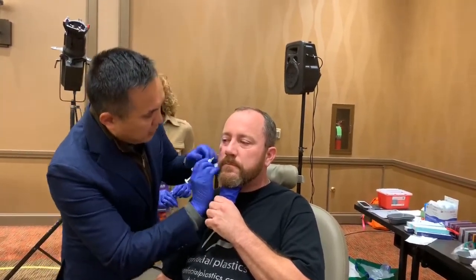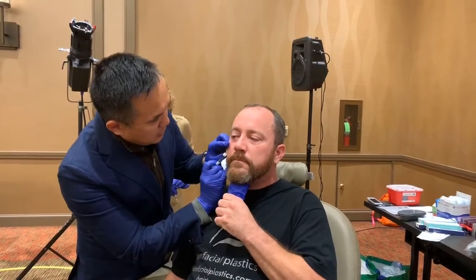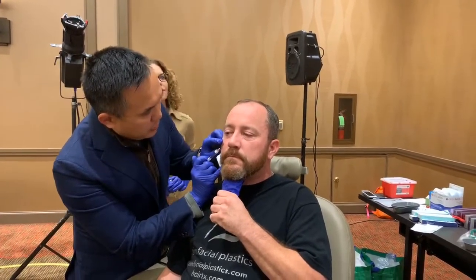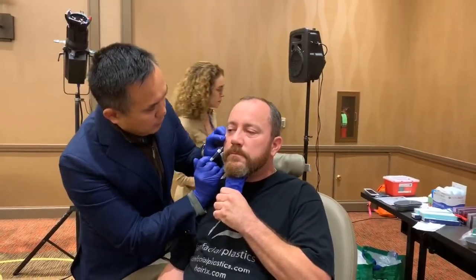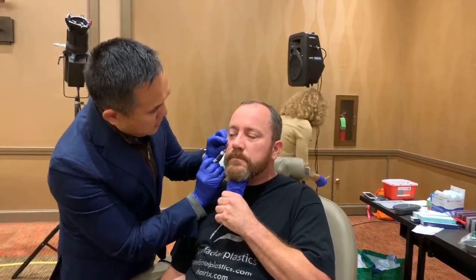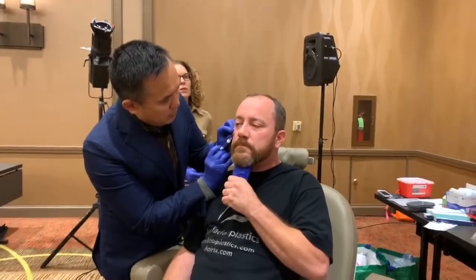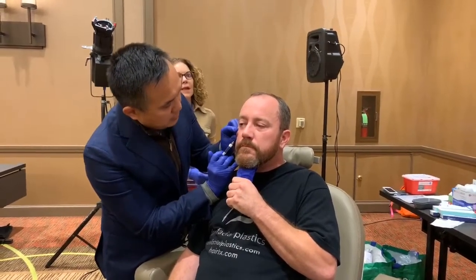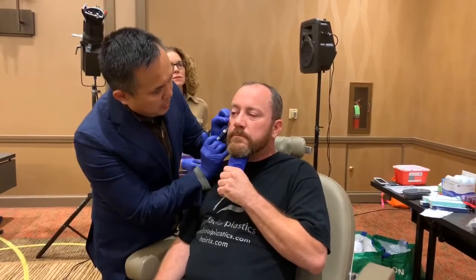Slow progress of injection — this is a 25 gauge TSK Classic cannula. I use either the Soft Fill 25 gauge or the TSK Classic. I don't prefer the Steriglide in my hands; I find it to be too sharp, essentially like a needle. I like 25 gauge because I feel it's the safest size with the least discomfort. I've migrated from the Soft Fill to the TSK Classic because the bore of the cannula is less and the patient has a little less discomfort. My tip is right here — I'm just migrating, dancing back and forth a little bit.